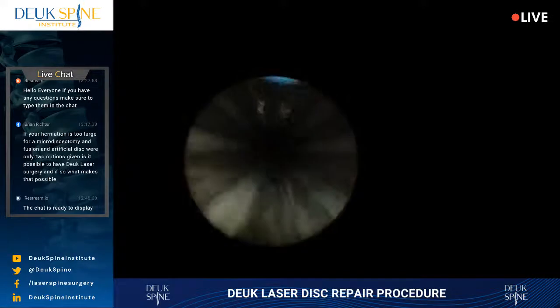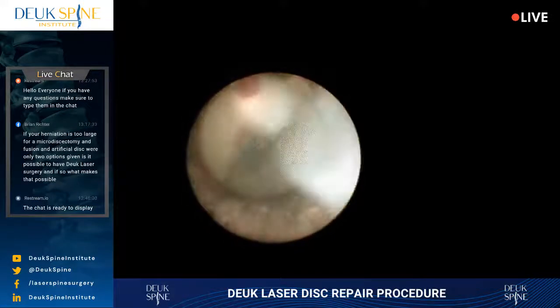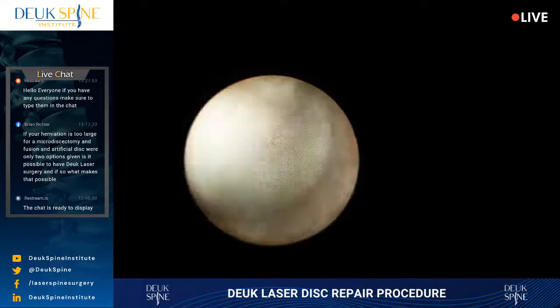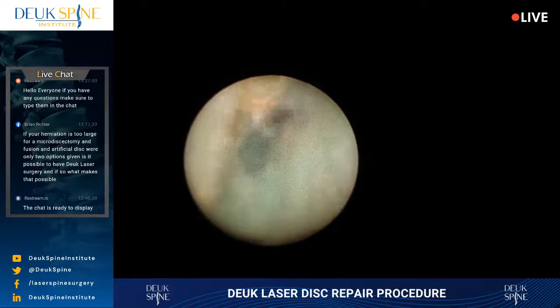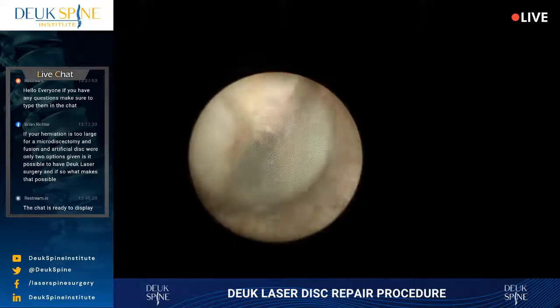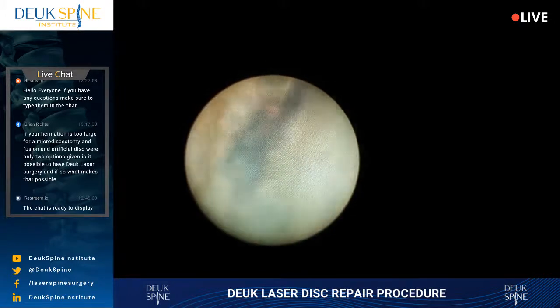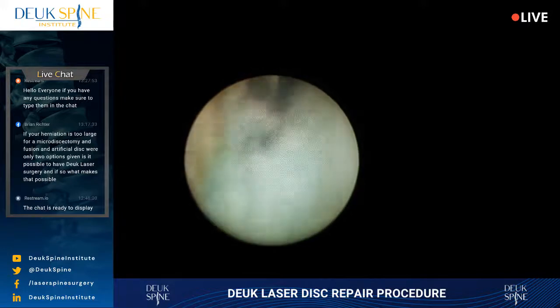Now the reason I was able to get it out is because of the laser. The laser actually jiggles out the herniations along with vaporizing tissue, because it creates a pressure wave. We call it cavitation in the liquid going down there. And that pressure wave blasts things like a pressure washer. So I actually have not just the burning and vaporizing of tissues, but also the jiggling that comes along with a good jiggler.